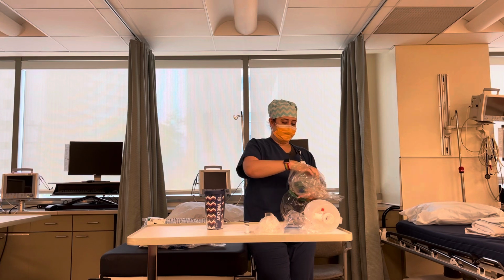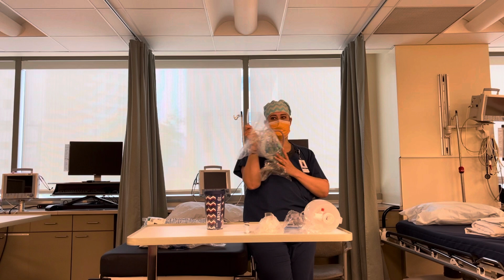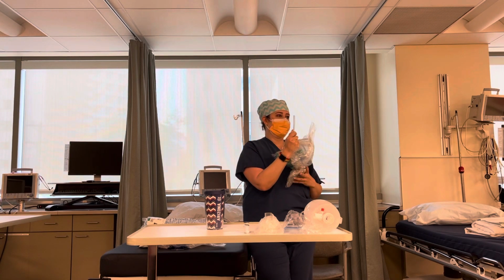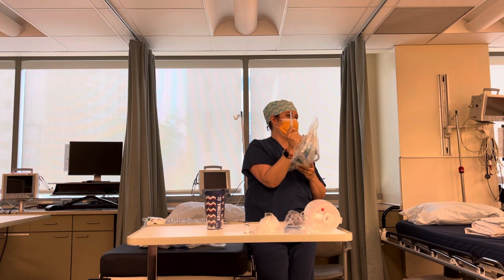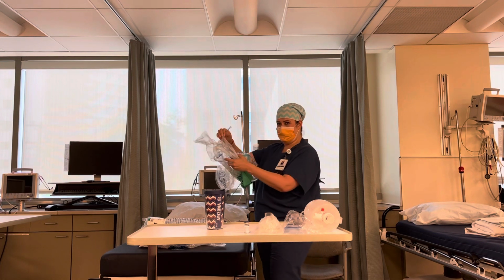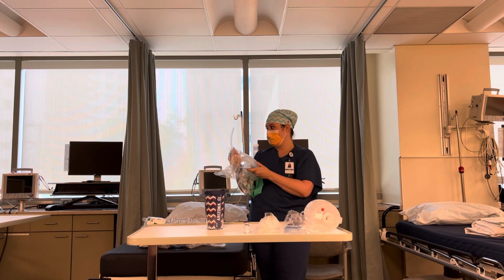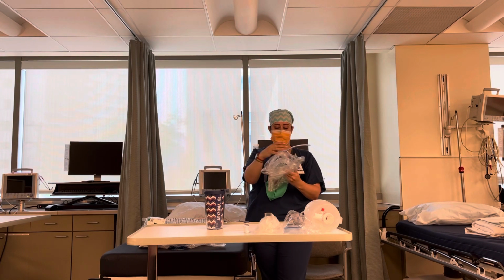There's been times, now I'm pretty good about telling all the CRNAs, that this connector comes with a big bulky thing that doesn't actually attach to the tree. So I know in the past I've had times when Lindsay's like, oh God, it's not attaching, and holding it on there. So now I just cut it off. Okay, so it should easily attach.